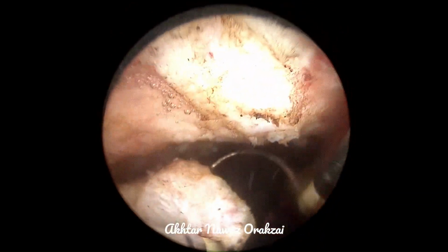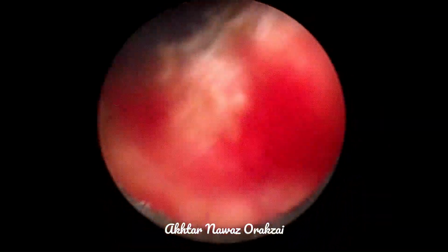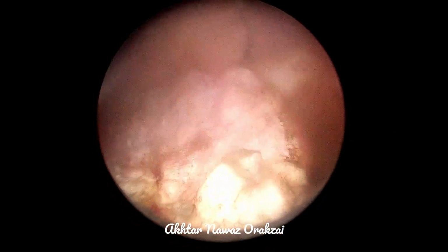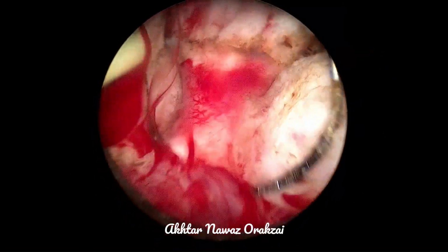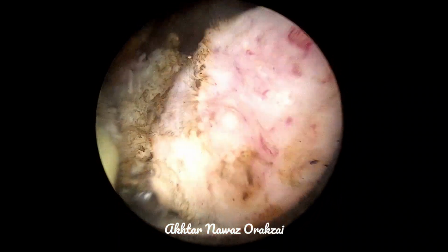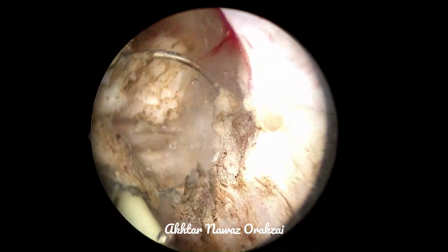Here again, you can see that resecting the lateral lobe has made the anterior lobe pop up and drop down into the cavity, so we have resected more of the prostate which has dropped down. Resecting the lateral lobe leads to popping up of the median, or rather the posterior lobe of the bladder. You can see the verumontanum. At no point during the procedure should one come distal to the verumontanum.